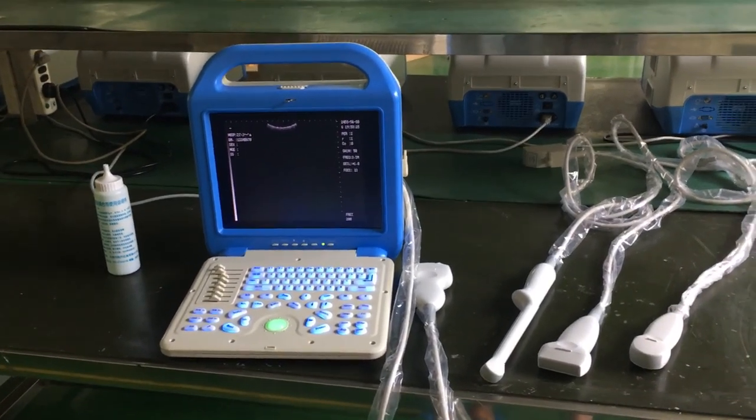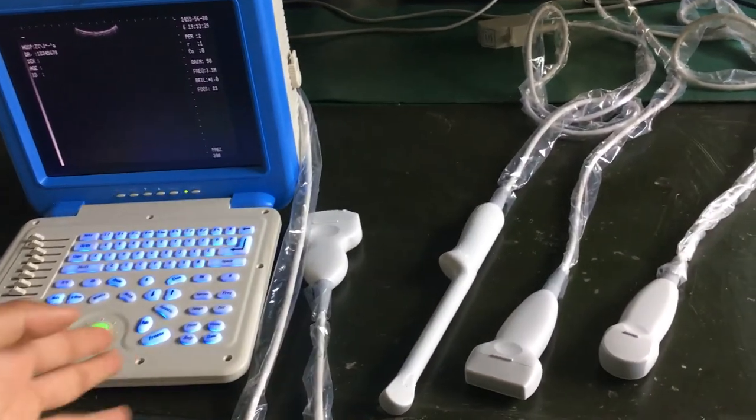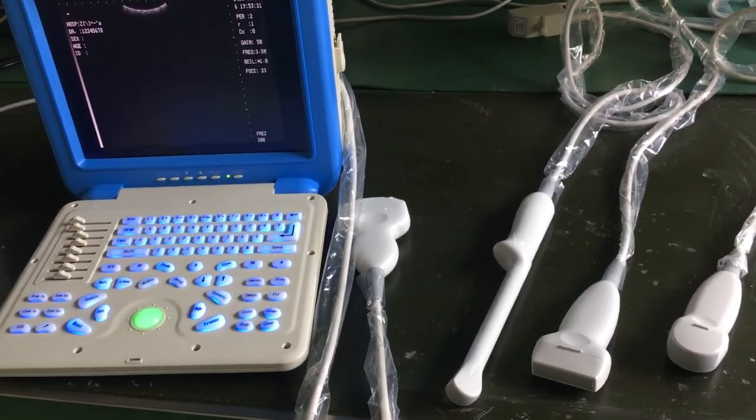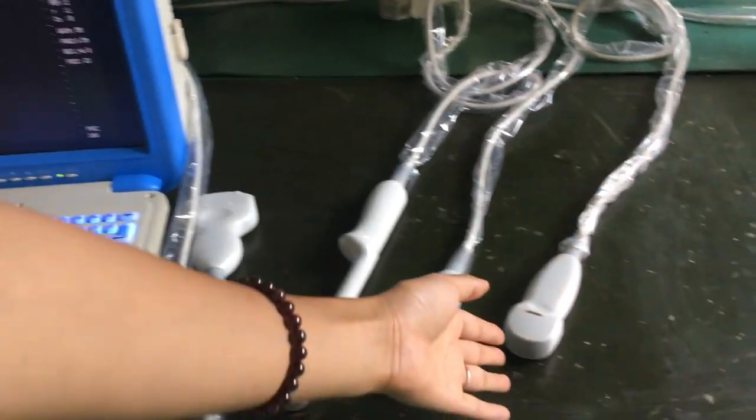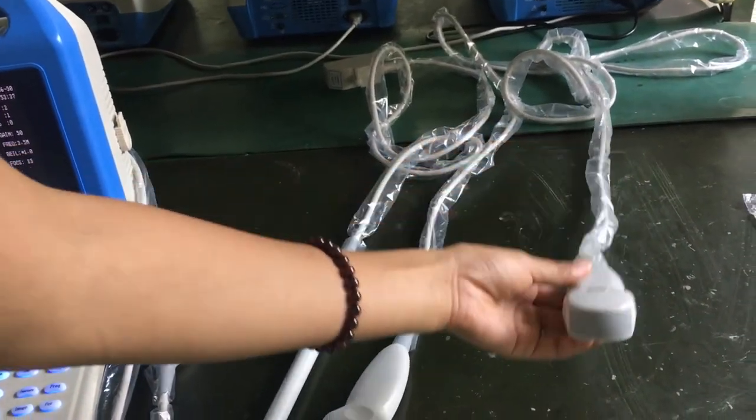Today we show this machine for human use. This machine can connect four different probes. The micro-convex probe is for heart use and small part use.